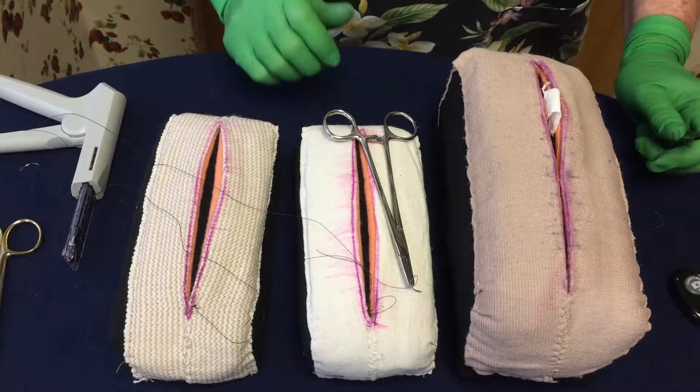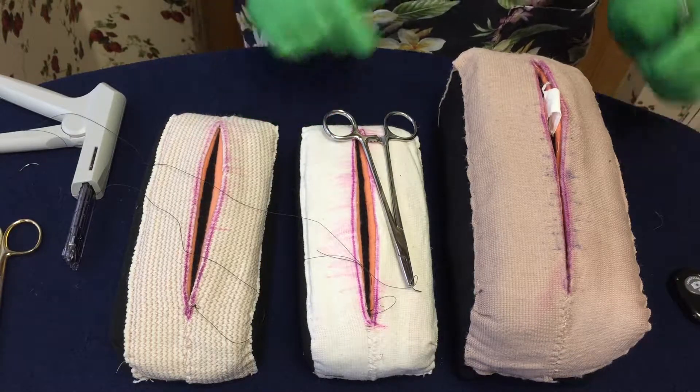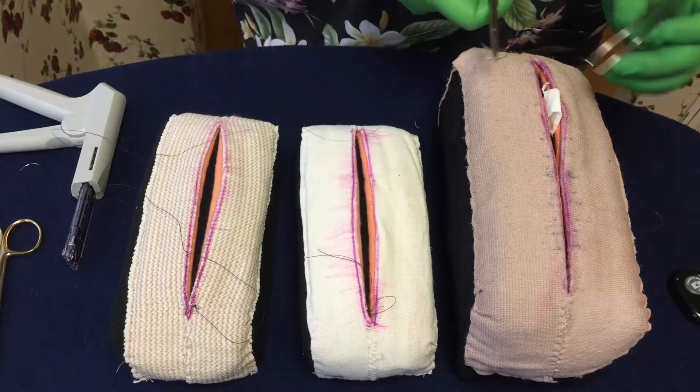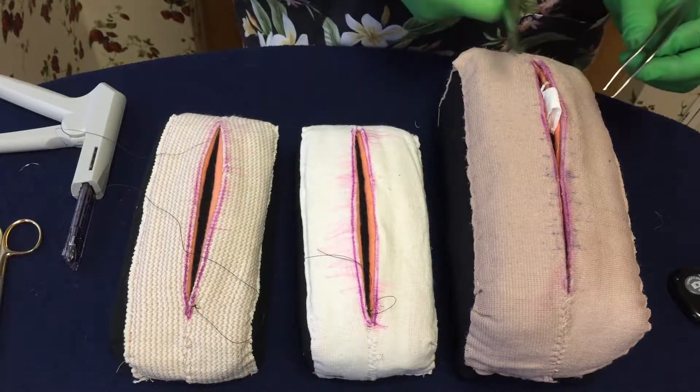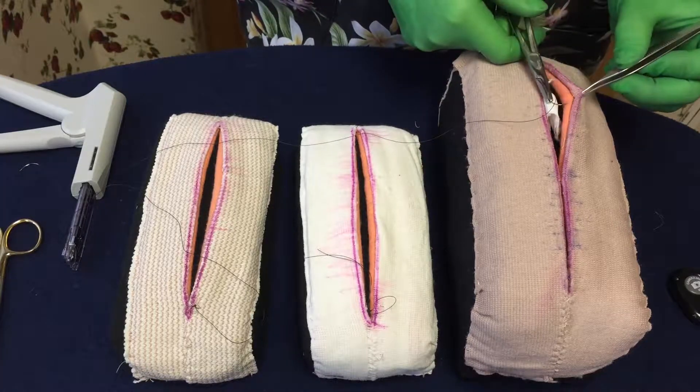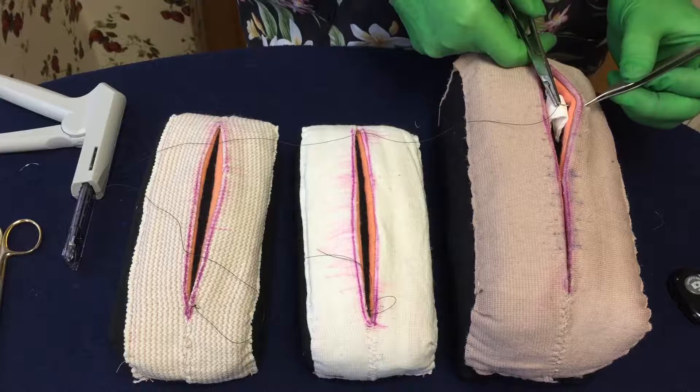We're going to talk about a few more things with the suturing techniques. We're going to talk about extruding tissue — there is another video that actually shows it on a person, but maybe I can demonstrate. So you have extruding tissue. You want to be sure you take your bite without grabbing that extruding tissue, so you go on either side of it.